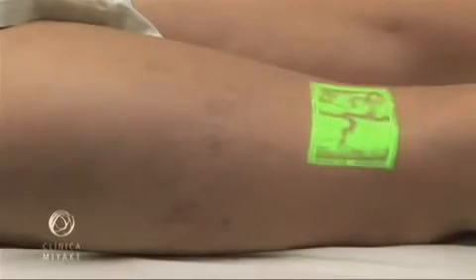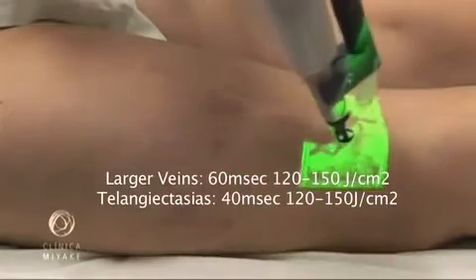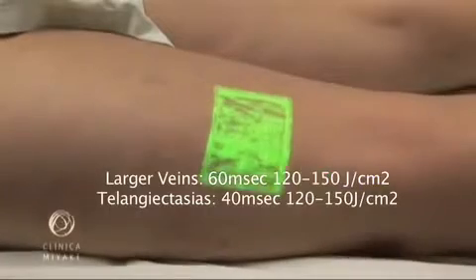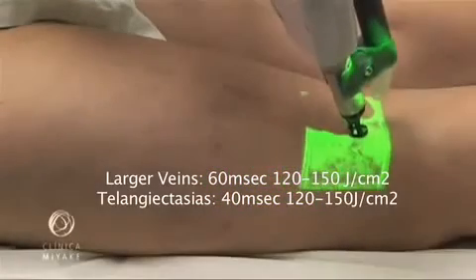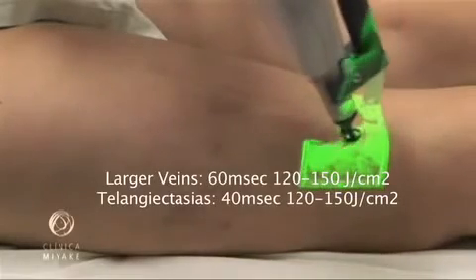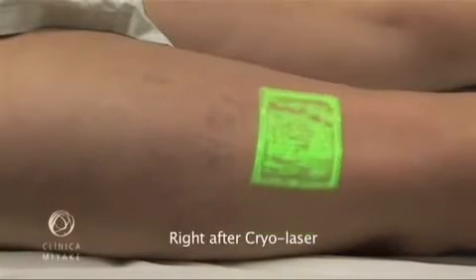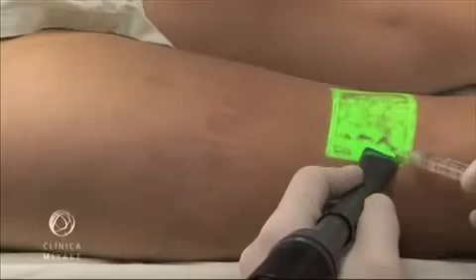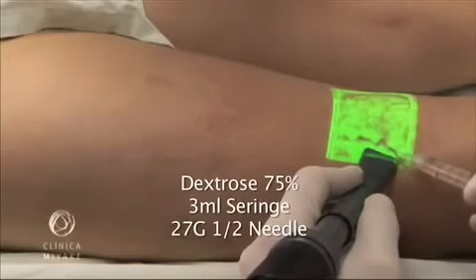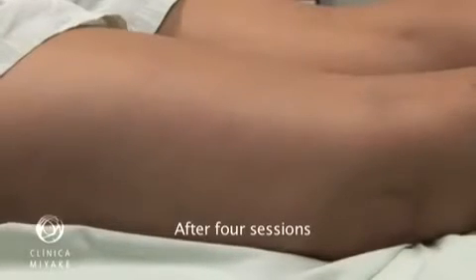Settings we use today are 60 milliseconds pulse duration and the fluence of 120 to 150 for feeder veins and small varicose veins. After treating the feeder veins, to treat the telangiectasias, we change the pulse duration to 40 milliseconds, keeping the fluence. In both situations, we are allowed a second and even a third pass. After the laser shots, the sclerosant is injected also under cooling where the vessel is still open. And this is the result after 4 CLACS sessions.